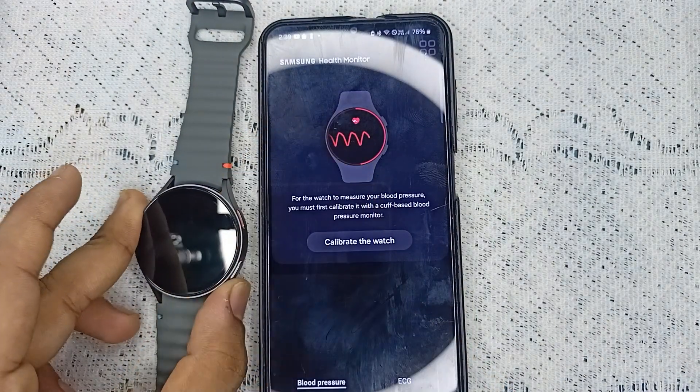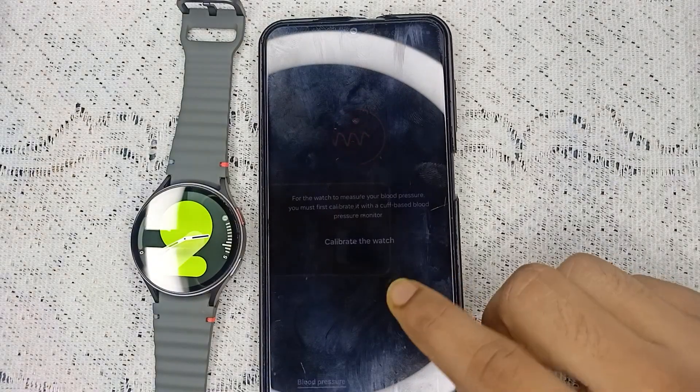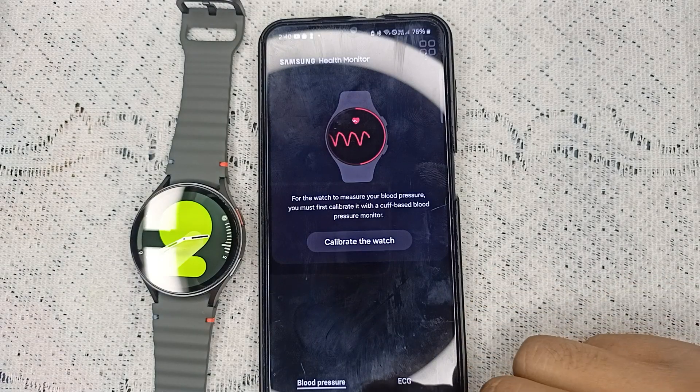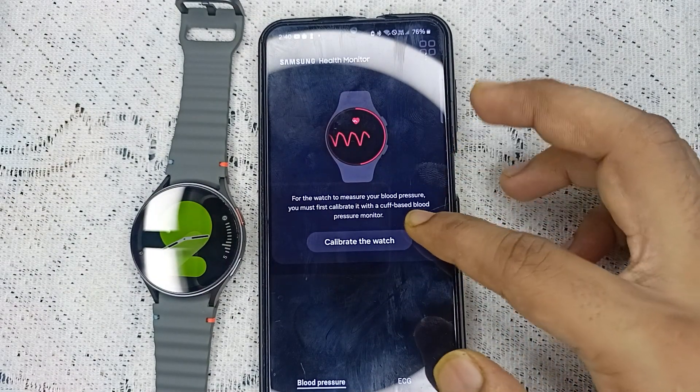Hello guys, welcome back to our YouTube channel. In today's video we will see how to calibrate blood pressure on Samsung Galaxy Watch 7. Without wasting your time, let's get started. To calibrate, simply open the Samsung app on your smartphone, and you will see a blood pressure section where you can tap to calibrate the watch.